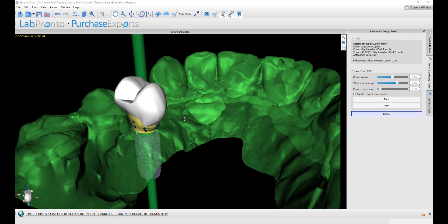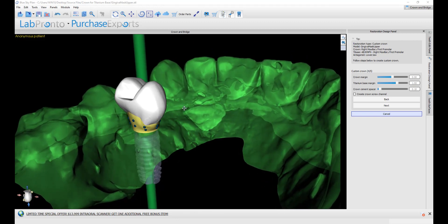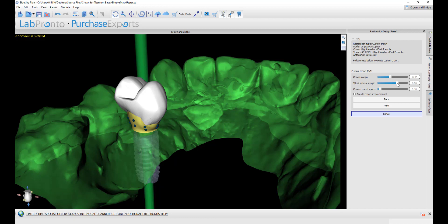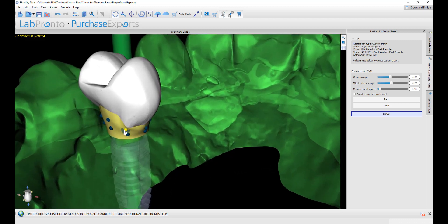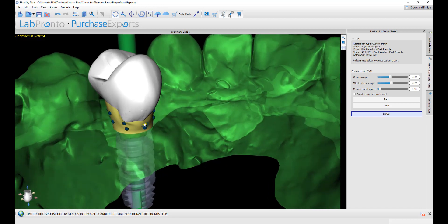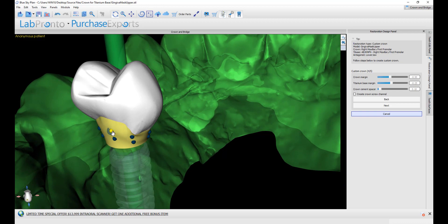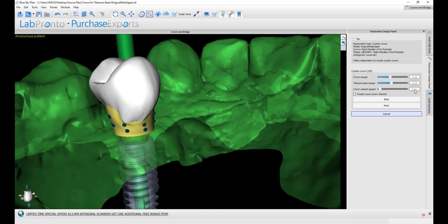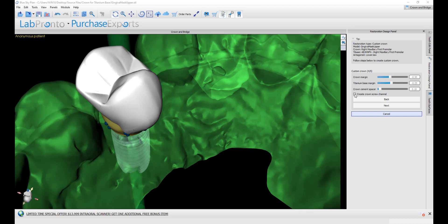Now the software has created the crown and the connection to the titanium base platform. In this step, we could use the sliders to adjust the crown margin. We could see the margin between the crown and the connection to the titanium base. We could also adjust the titanium base margin as desired. We are also able to grab and drag, with our left mouse button, any of the nodes that we see in the bottom section to edit the connection. The crown cement spacer default is a tenth of a millimeter, and the intention of that is the spacing between the titanium base and the crown that will be on it. We have the option of creating a screw channel by checking the create crown screw channel box. We continue by pressing next.